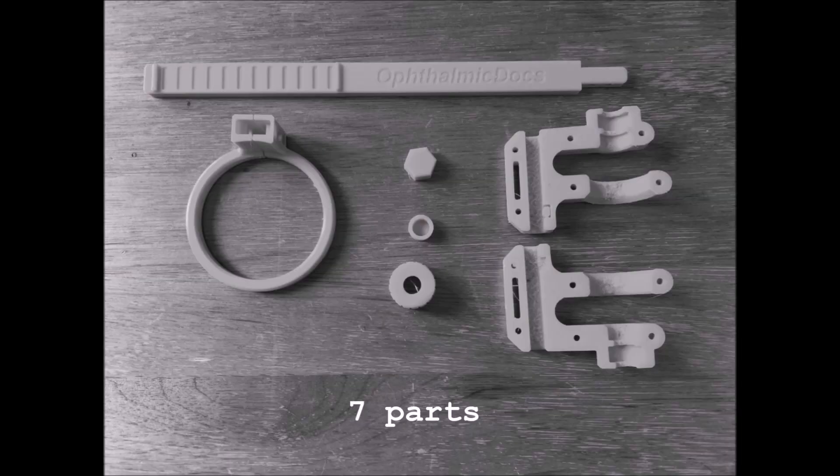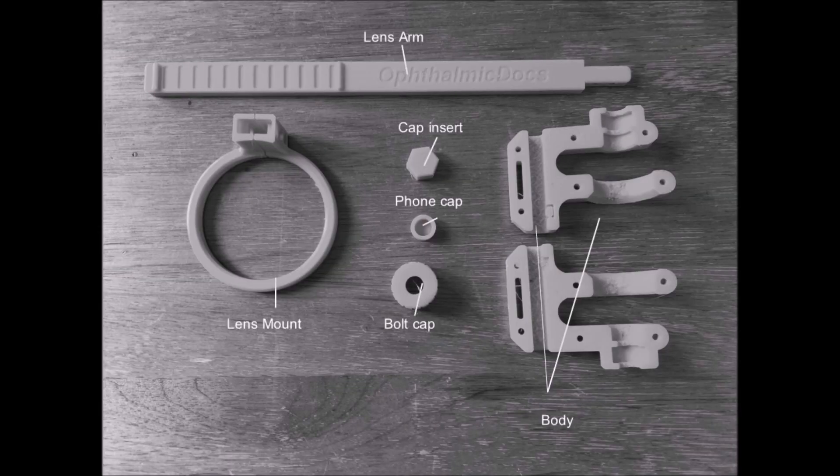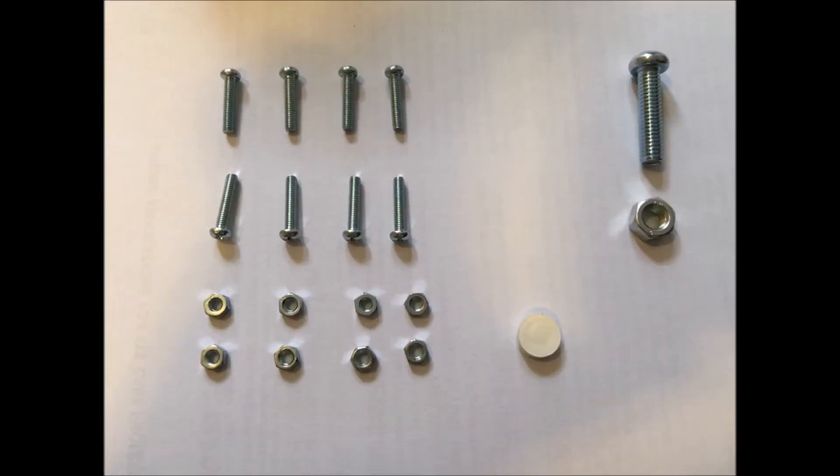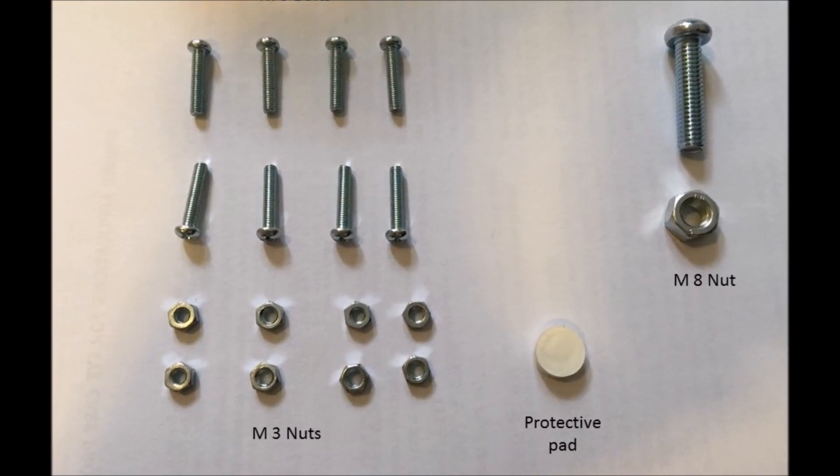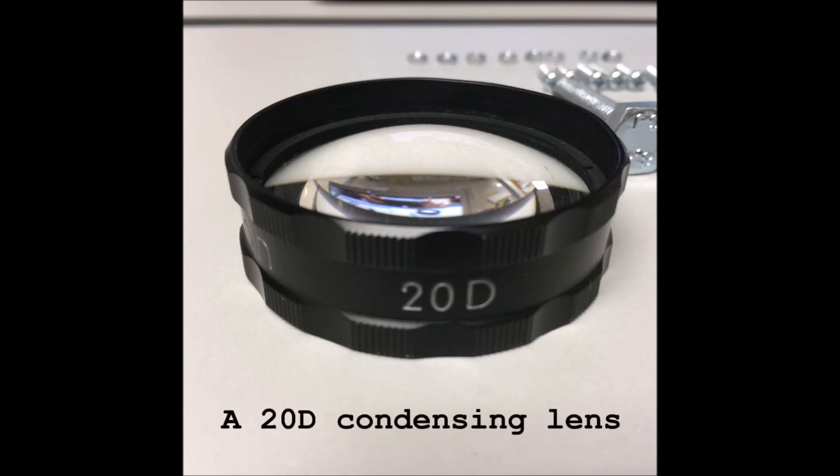First of all, make sure you have all 7 3D printed parts. You'll need a M8 bolt and nut, 8 M3 bolts and nuts, and a round protective pad, and a 20 diopter condensing lens.